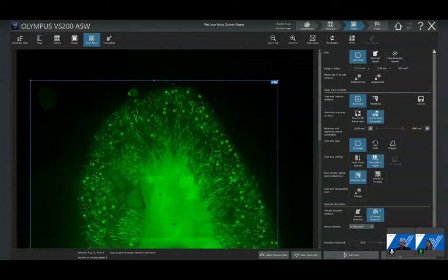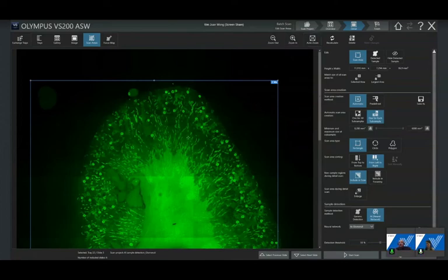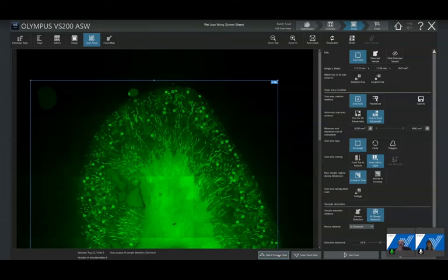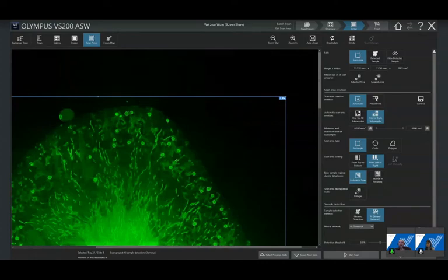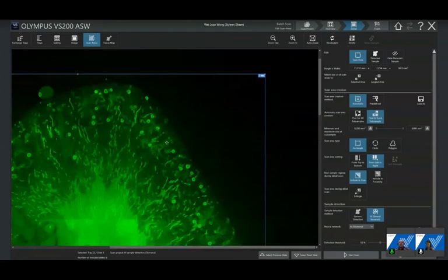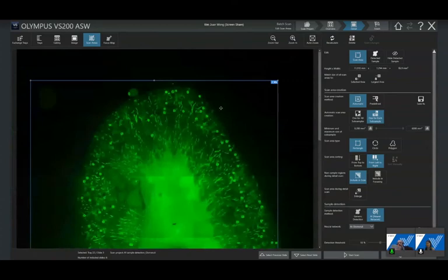Two key points to note: while working on the first slide, the system continued acquiring overviews of the other slides — that is the parallel working feature, the scan doesn't stop when you interact with the system. Also, you can train the system to recognize very complex structures and then scan only those structures, saving significant time since you don't need to scan the whole tissue — only what you need, at the magnification you need.